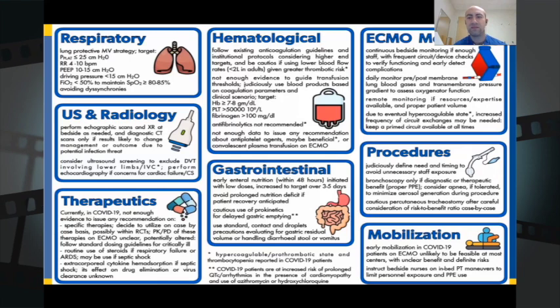So this is actually from that guideline paper published by ELSO. I'm not going to have you guys read this, but I will hit the main points on it. So per the ELSO guidelines, continuous monitoring of pre and post membrane gas and transmembrane pressures is necessary, at least daily blood gases, and then frequent circuit and device checks for clot are necessary. A prime circuit for emergent exchange should always be available. For procedurals surrounding this patient, they should be clustered and minimized to decrease staff exposure.